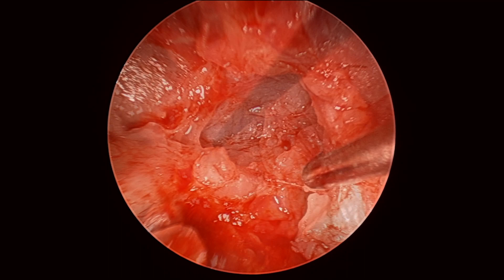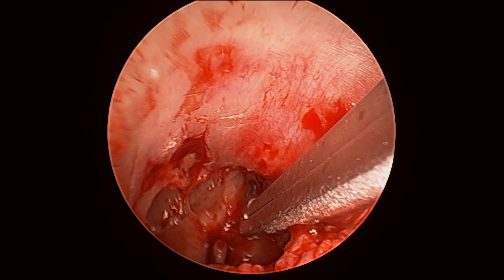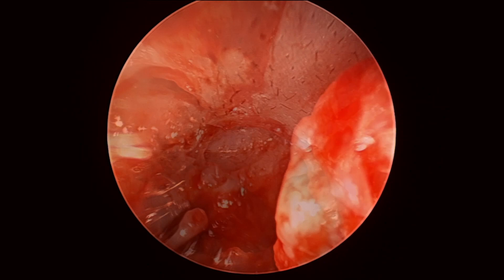Finally, an endoscopic curette is being used to clear the lateral aspect of the protympanum where the disease is residing, and a 45-degree long angled cup is used to remove the last attachment to the protympanum. After removal, we can see the clear super tubal recess and sub-tensor recess.